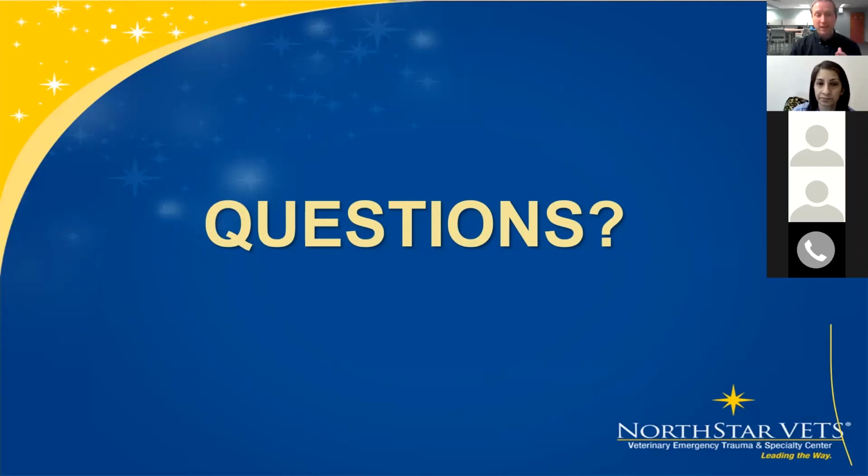Okay. Now this one's kind of fun, designed to keep you on your toes. All right. You're on a desert island, and you're running an anesthetic case, ASA grade 2. Your multi-parameter machine is at the bottom of the ocean. What two devices would give you the best information? I would want an end-tidal CO2 monitor in that situation.